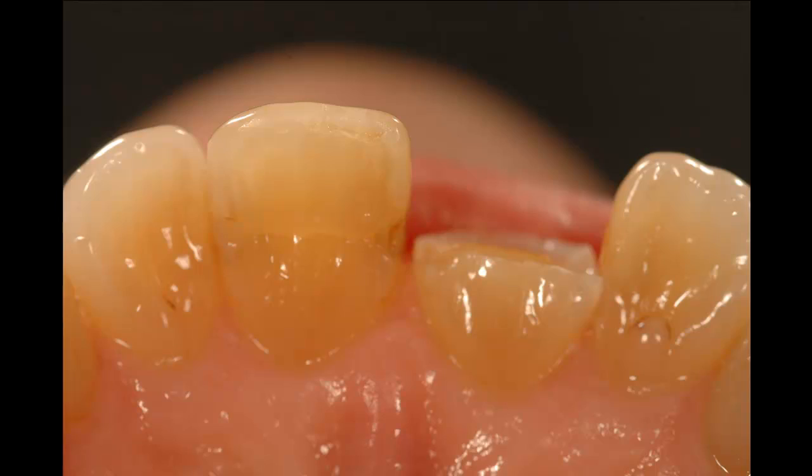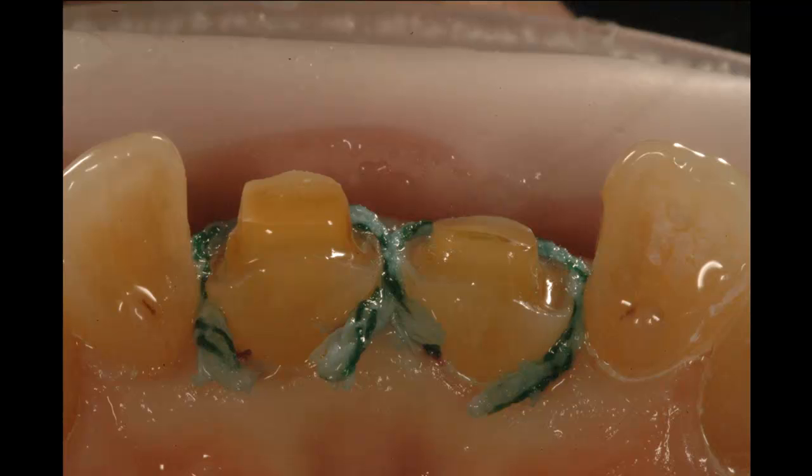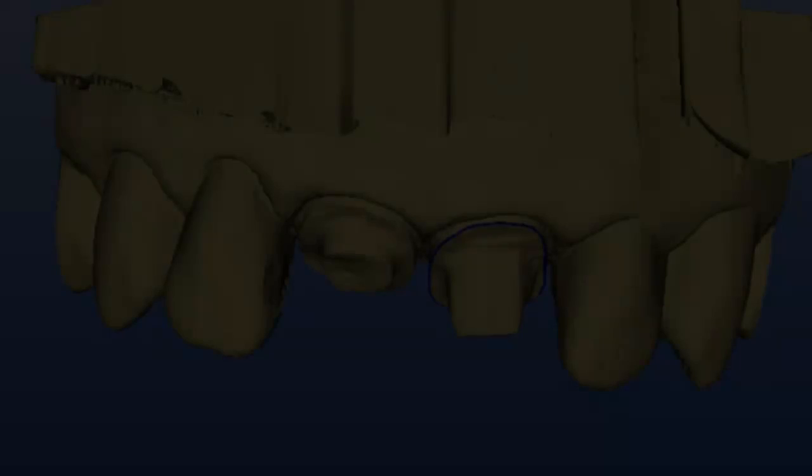I decided to prep the broken off central just around the margins down the facial to the tissue, and on the other central I tried to prep the lingual margin at the crack. You can see how the crack actually travels up a little more incisal, as you can still see it in the side of the tooth. But I've tried to preserve as much lingual cingulum as possible to give the tooth some strength and give me something to bond to. So I think I'll switch over to the case on the CEREC unit.